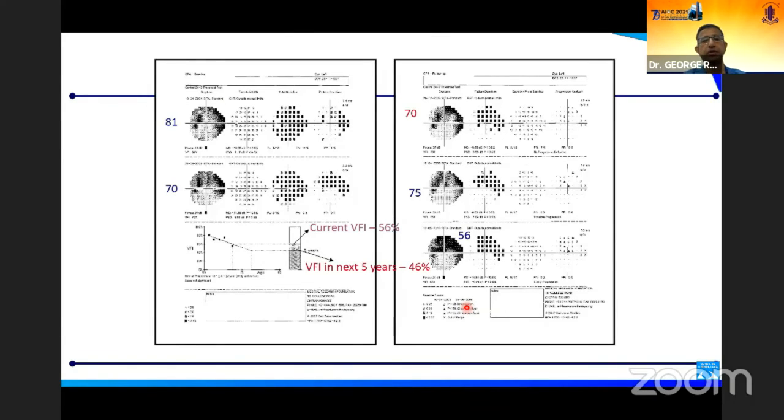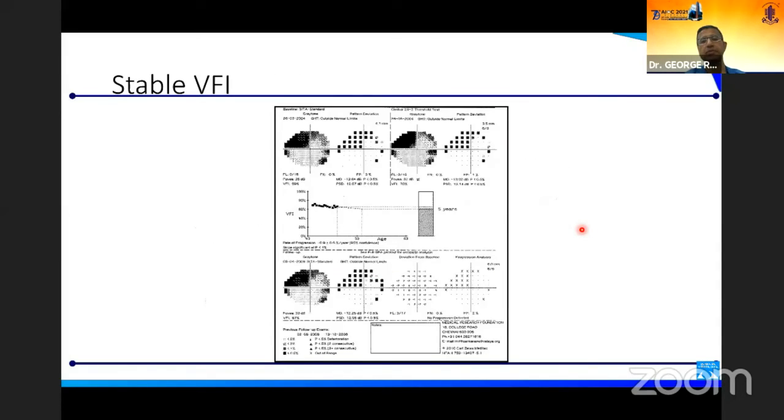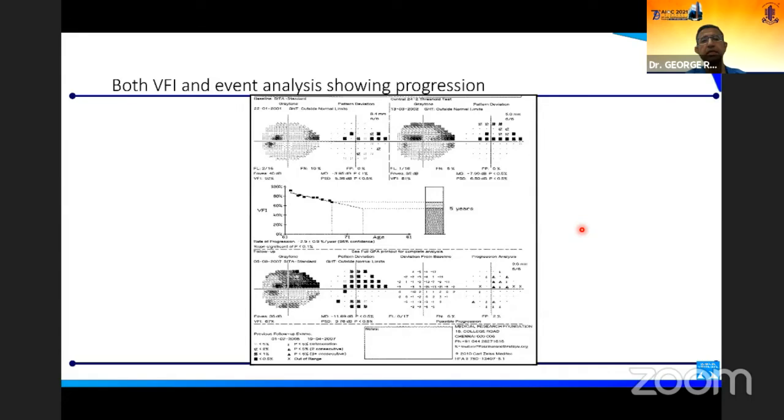When you put this entire information together, this is what you would see. You would see a VFI bar there and these are the VFI numbers on the side showing how it's getting worse. You can see on the event analysis too, things are getting worse. But what is typically given is a single printout like this. Here you can see that the VFI is not showing much change over time, neither are the event analyses. Here both the visual field index trend and event analysis are statistically significant. Here also you have multiple points getting worse.